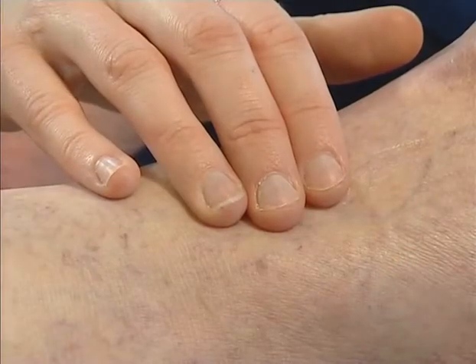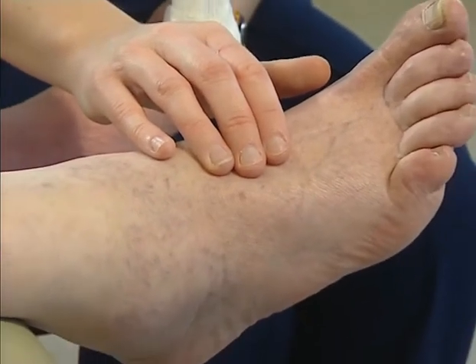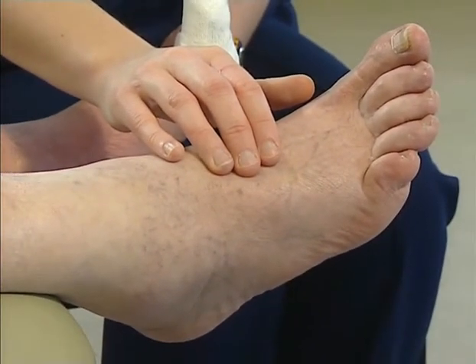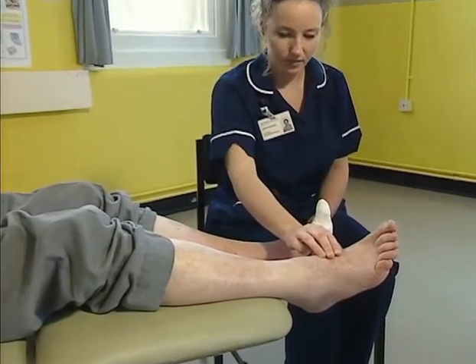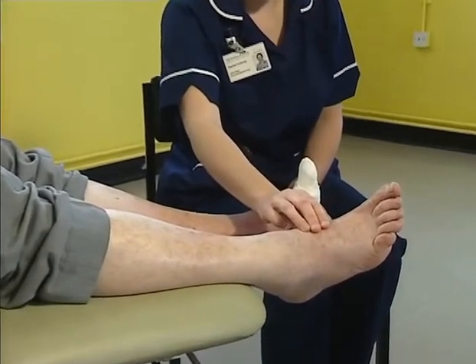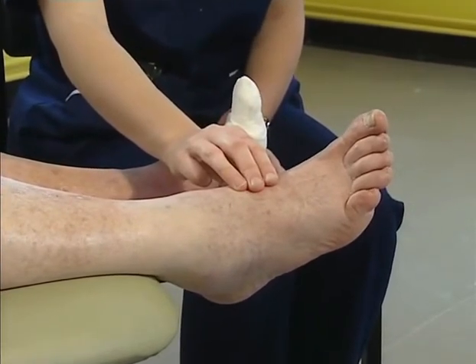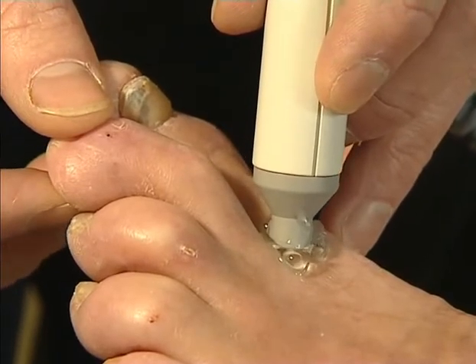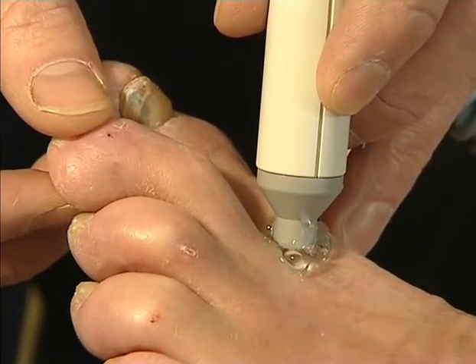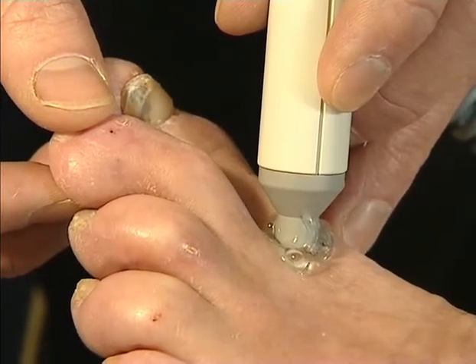You may find that occasionally you cannot feel a pulse, but the foot looks healthy, well perfused, and feels warm to the touch. This may be due to the arteries being situated very deeply, or in a different position to normal, or due to the presence of edema. A useful tip is that if you cannot find the dorsalis pedis pulse at its usual site, try the base of the first and second toe.